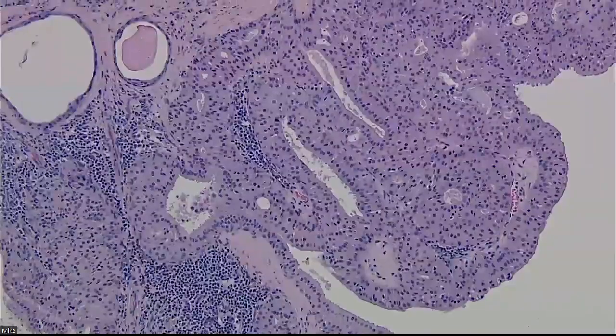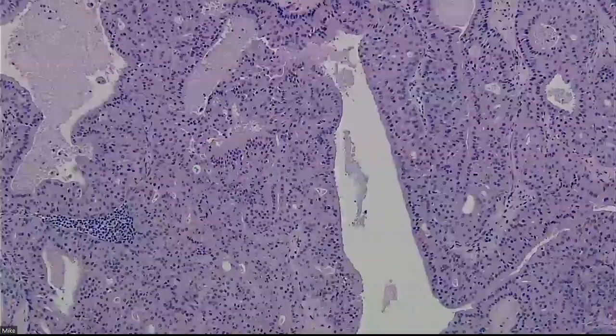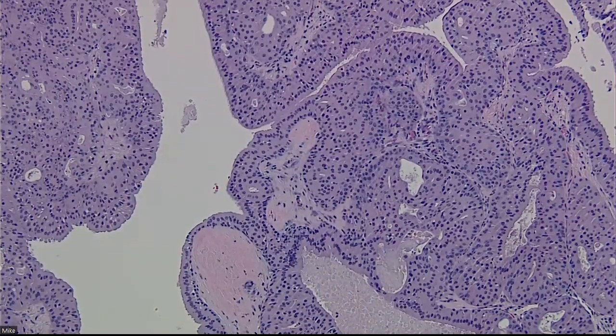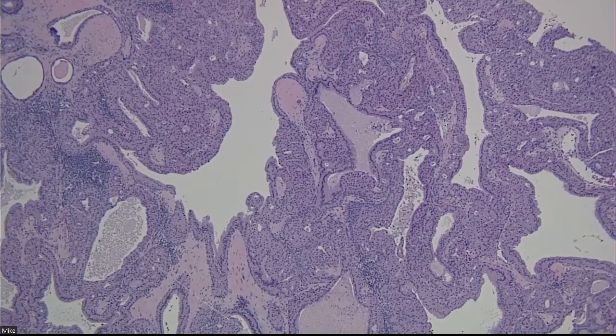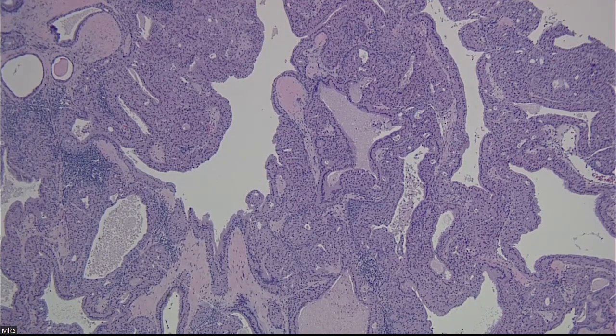Sometimes I just see it. As long as it's not pleomorphic, atypical or malignant appearing, it's just a proliferative area in a Warthin tumor, so I would still be okay with this. Once resected, these Warthins don't really recur. No, they do not.